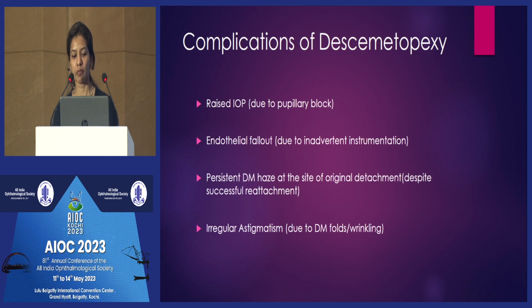Very rarely we've had to take up the patient to release air in the theater and form the chamber again. But these are some things. You could give mannitol and Diamox if you don't want to take in the patient once. But the minute you notice a synechia forming, I think you will have to release the air and form the chamber with saline at least.